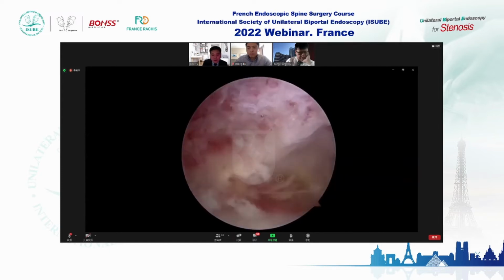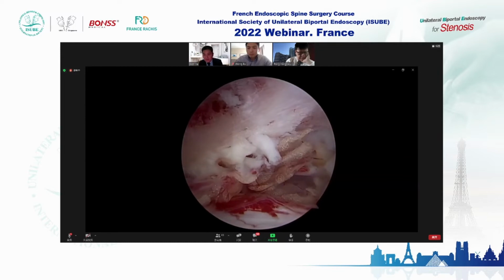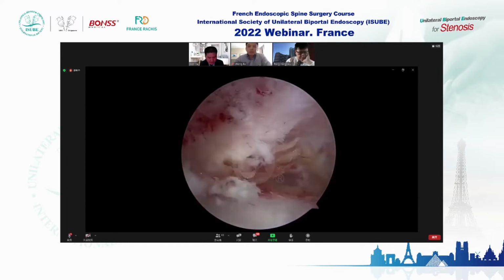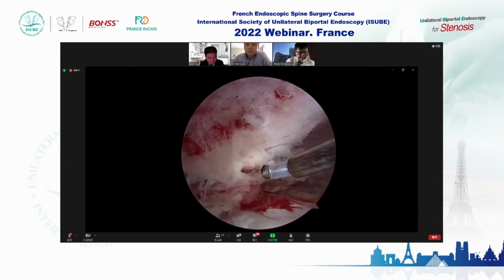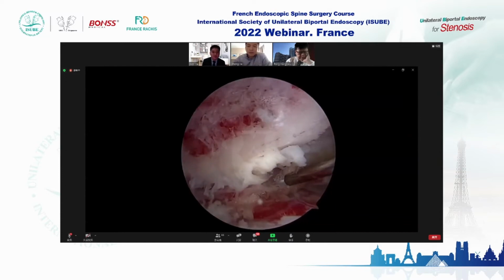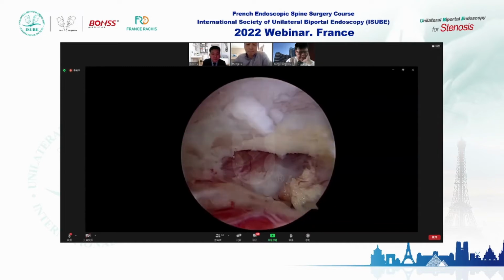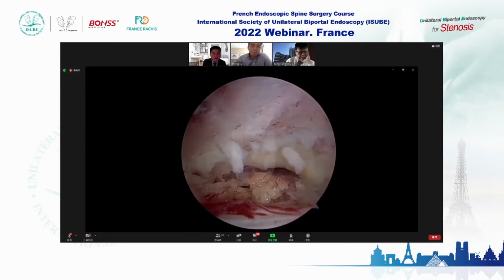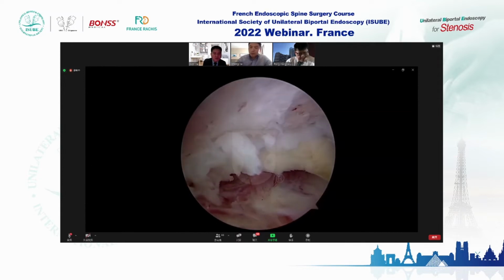To answer Dr. from Indonesia, OK？刚才有个印度尼西亚的教授问了这个问题。If we remove the tip of the SAP, we can expose the long part of the exiting nerve root.